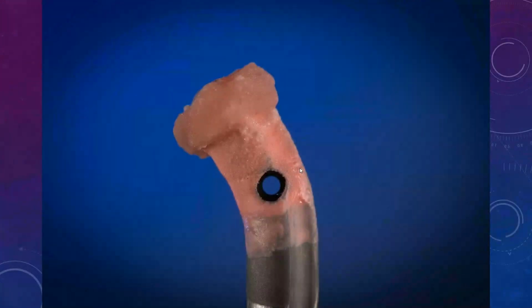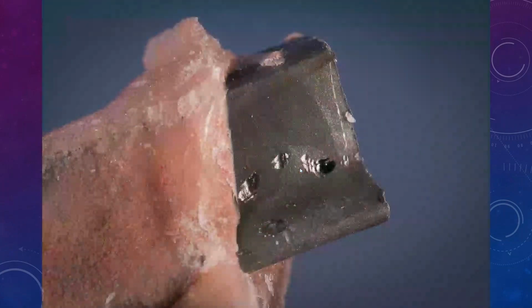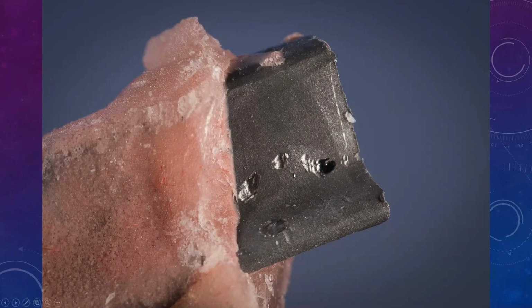And I've done some testing where I try to break it apart using this method and the other. In the areas where I didn't put any acrylic powder into the opaque, the acrylic just broke away from the opaque, no problem. But when I did use the powder, it was a lot harder to break away, and it would break away from the metal and not from the opaque, so the bond was a lot stronger.